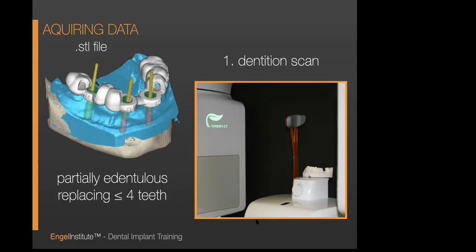So the first way is you can take an impression, you can send that over to 3D Diagnostics and not do anything about it. The second way is you could take an impression, as you see here on your screen, you can pour up a model, have a lab pour up a model, and you could put that in your scanner and you could scan it. If I had my preference to guide you, I would tell you, go ahead and send your impressions directly to 3D Diagnostics. They have some heavy artillery to do some pretty hardcore scanning, and they will probably get more detail than you will.